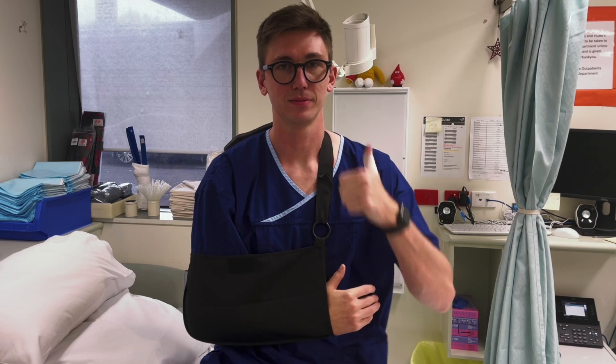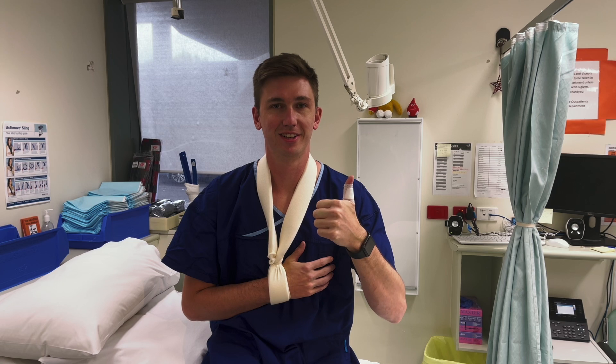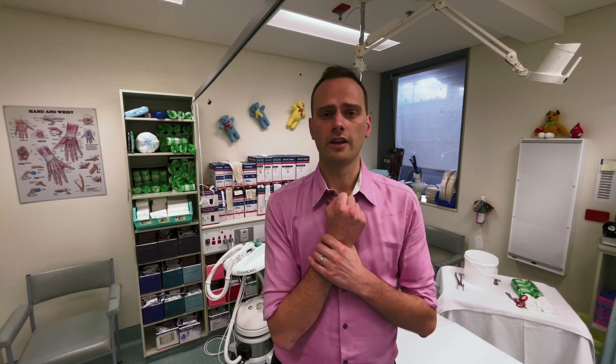A broad arm sling is designed to support the weight of the elbow and actually lift the shoulder up to take the pressure off it and stop it from drooping down. A collar and cuff is designed to hold the hand via the wrist to the neck and let the elbow hang free, which provides some gentle traction to the proximal humerus.